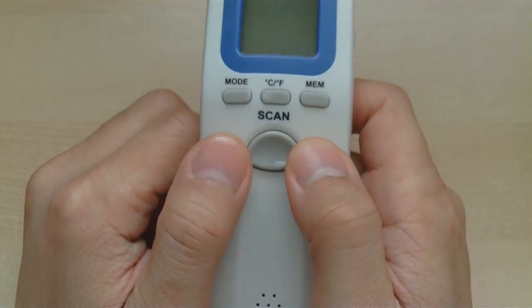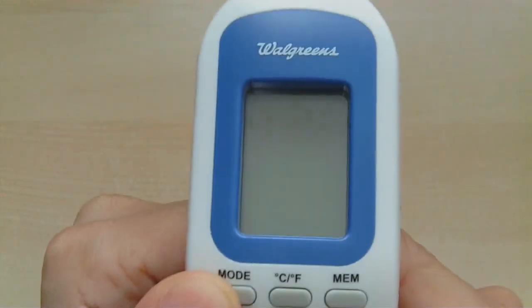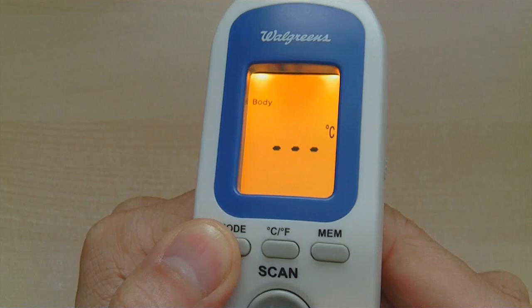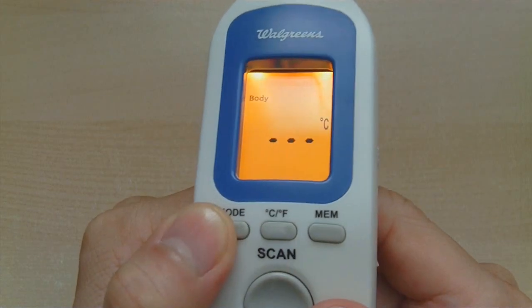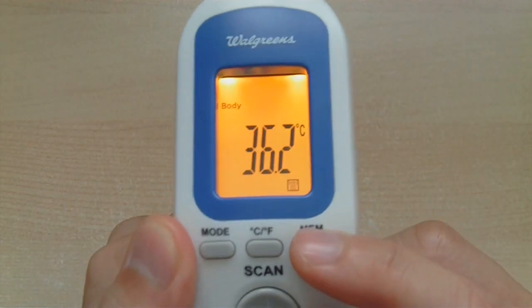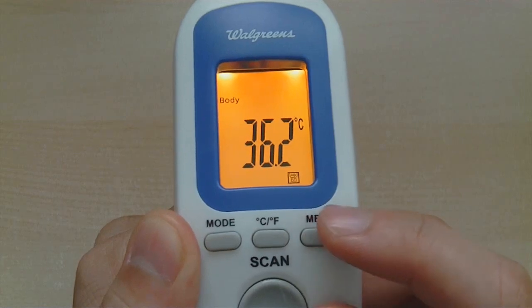You just hit mode to change modes and cycle through room, surface temperature, or body — choose the one you want and hit scan. Very simple to use. Memory can be used to check the memory settings: it shows 36.2°C Celsius and 23°C surface temperature, just like what we just did.